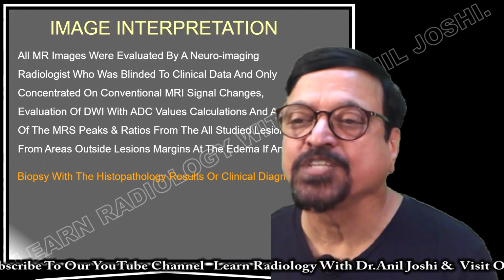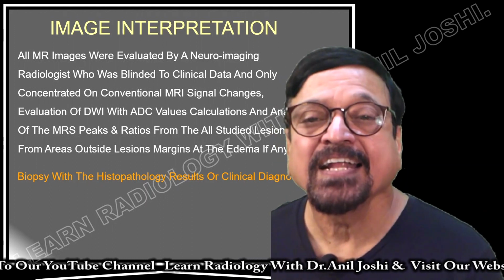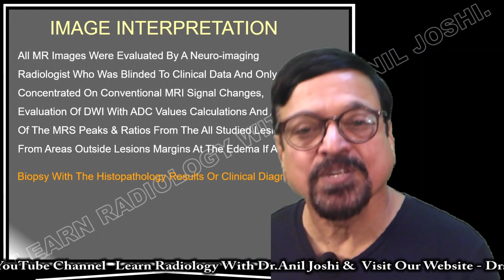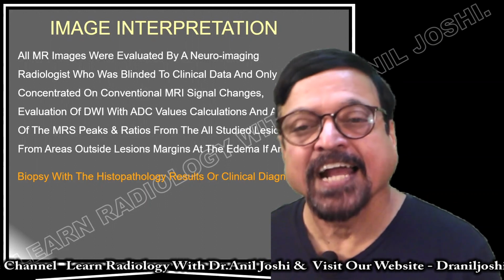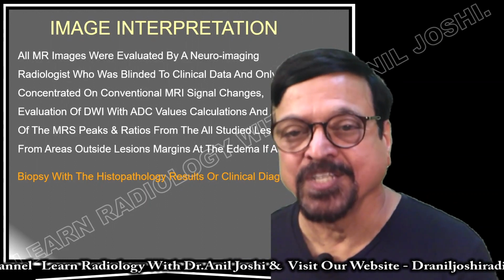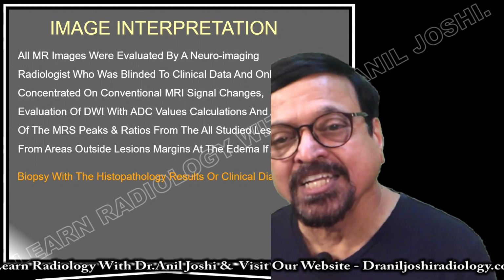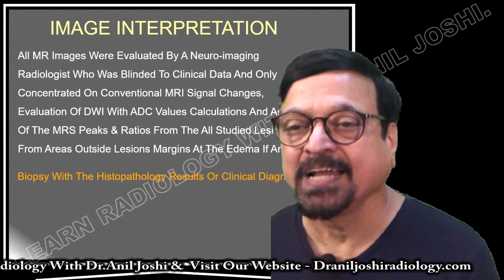Now, biopsy with the histopathology results or the clinical diagnosis are a gold standard. Histopathology is a gold standard. What MRS does is it tries to avoid the biopsies, or it tries to take a clinician as near the diagnosis as possible, especially if you are dealing with malignancies.